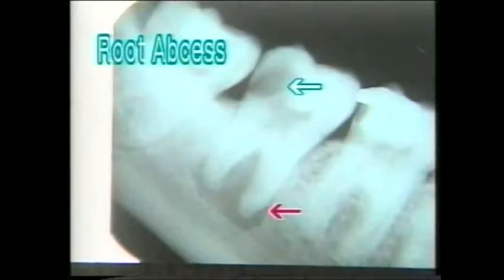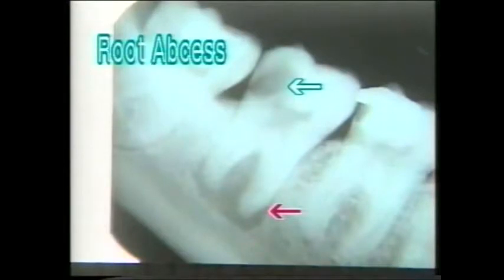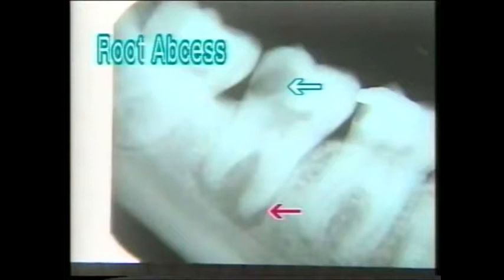Root abscess is an osteolytic lesion around the root of a tooth. The red arrow points to the circular area of bone destruction around the root of this tooth, and the white arrow points to the caries with destruction of the crown of the tooth, forming a radiolucent cavity within the tooth.